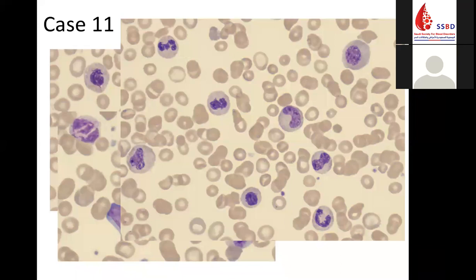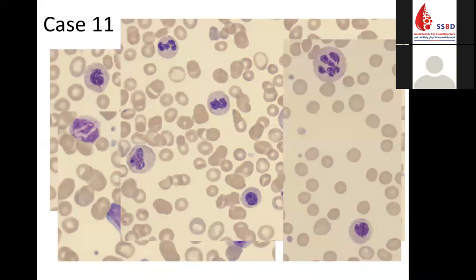So this is a dysplastic change in the circulating neutrophils, mainly abnormality in the nuclear, few hypogranular cells, rare blasts, and this is a bizarre segmentation in the neutrophil together with monolobed neutrophils. You can tell that this is a dysplastic neutrophil comparing the cytoplasm. They have the same cytoplasm, same granularity. However, the nucleus is abnormal. So definitely all of them show the same cytoplasmic granulation features and the nuclear chromatin pattern. So what do you think?